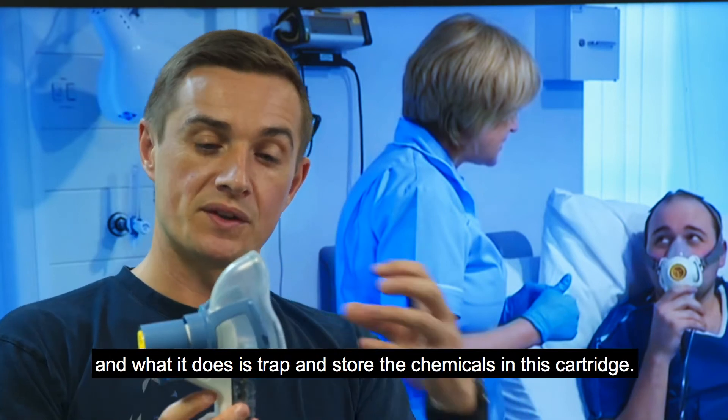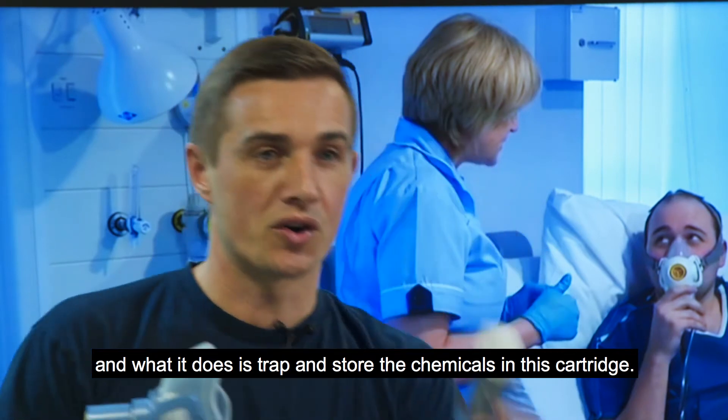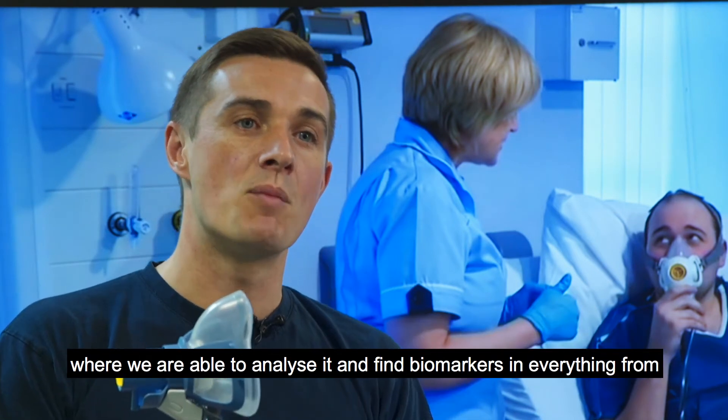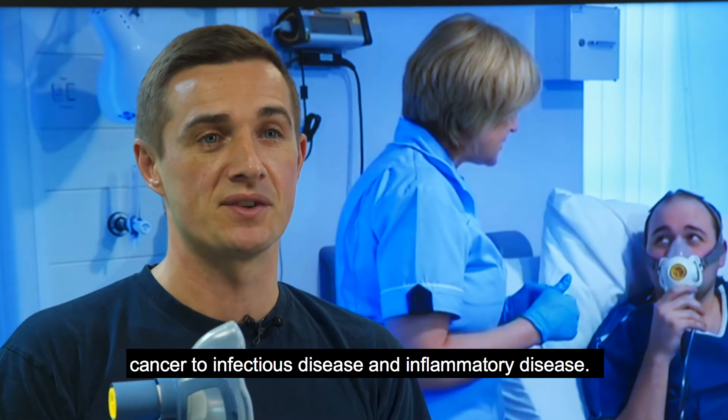What it does is trap and store the chemicals in this cartridge. The cartridge can then be removed, sent back to our breath biopsy lab in Cambridge where we're able to analyse it and find biomarkers in everything from cancer to infectious disease and inflammatory disease.